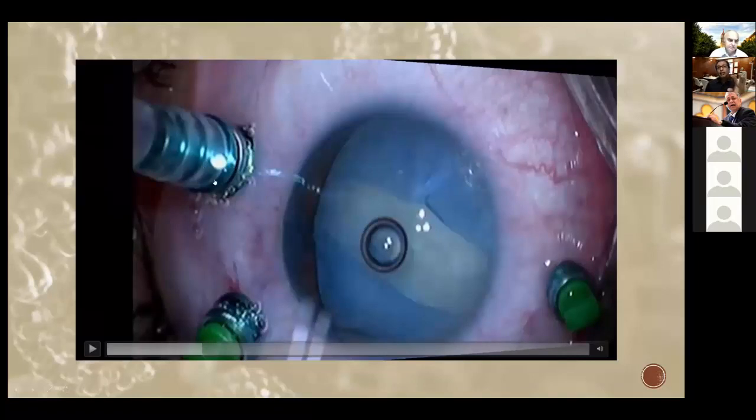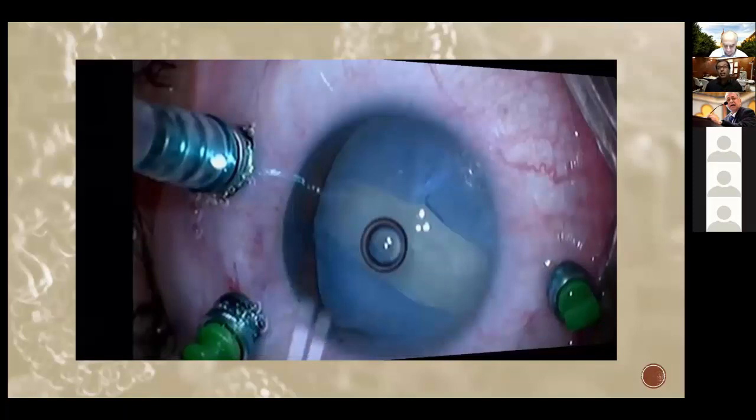And I think this is the explanation I got, because I had a very deep anterior chamber. What I did is I pushed in the viscoelastic, but the vitreous had leaked, or I had a posterior hypotony. So what happened is the whole nucleus, the whole lens was pushed to the back, and there was stress on the zonules rather than equalizing the pressure inside and outside the lens.